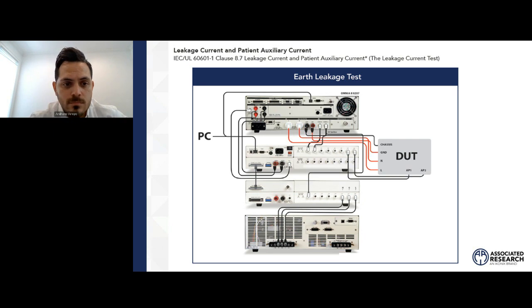That's a great point. So mains and applied part hypot, no wait, I'm sorry, applied part hypot test, right? I have my high voltage sent to my scanner. And so that means I can apply high voltage to any of these applied parts and return on chassis or return on mains. That's what Bashan was referring to.